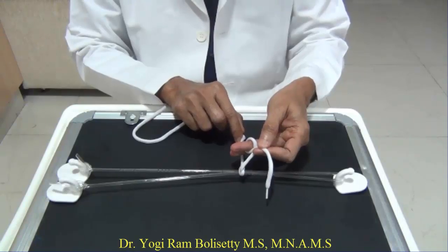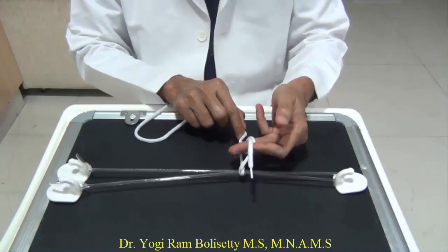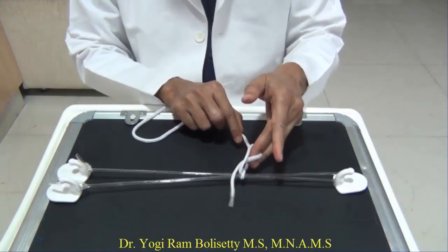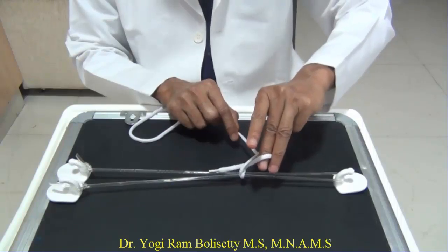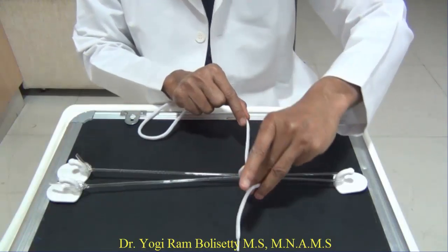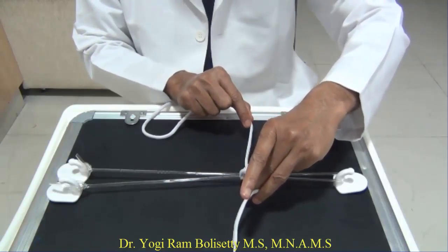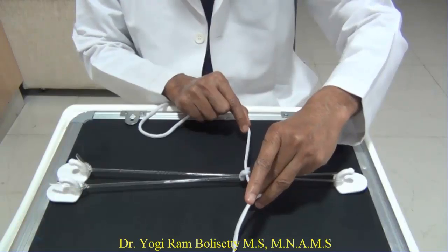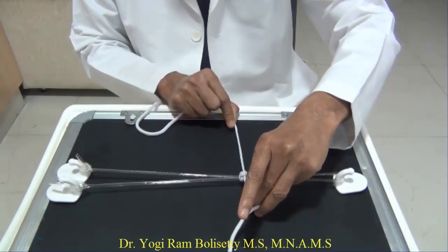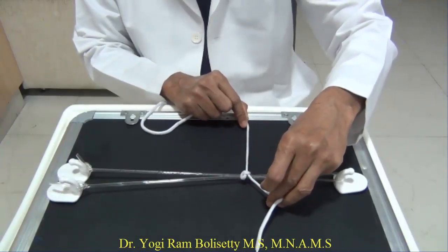Now, you grasp the short strand between the middle finger and the ring finger and leave the thumb and index fingers. Now, get the short strand through the loop outside by pronating the left hand. Now, the second throw is ready. Now, keeping both the strands straight at 180 degrees, pull the strands in exactly opposite directions, tightening the second throw. So this is a secure reef knot.